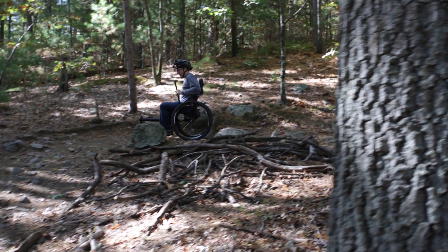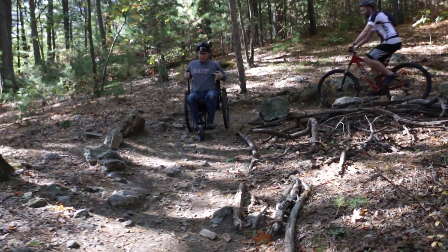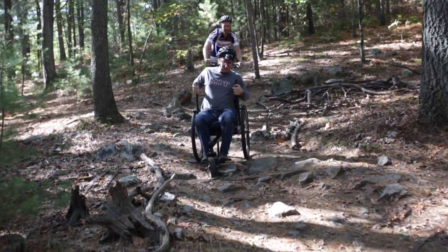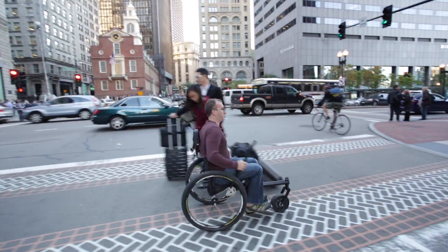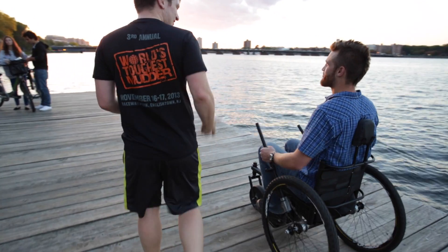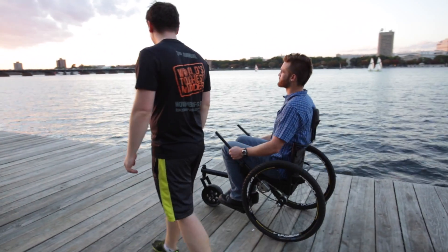The Freedom Chair is an off-road recreational device that's basically like a mountain bike wheelchair. It helps people of all abilities go off-road and ride around on rough terrain, ride more effectively on smooth terrain, go on sidewalks, go over uneven curbs. It's really an all-terrain machine that takes people off the pavement wherever they want to go.